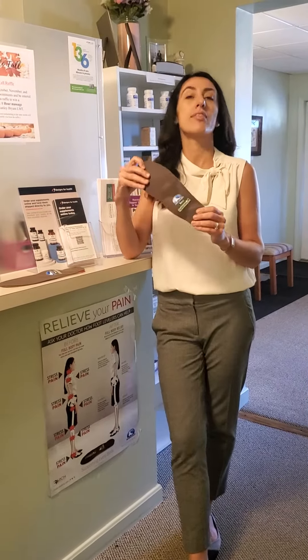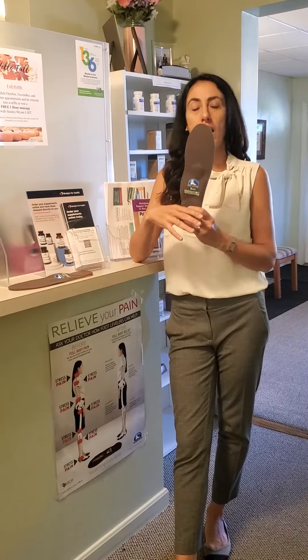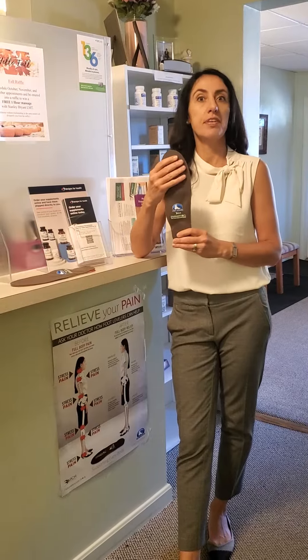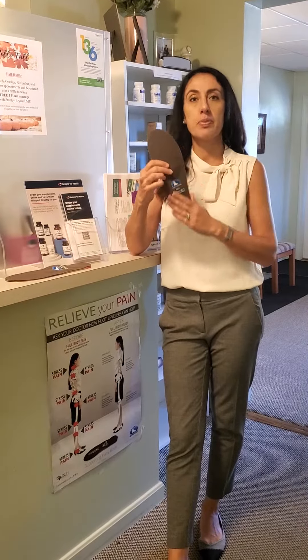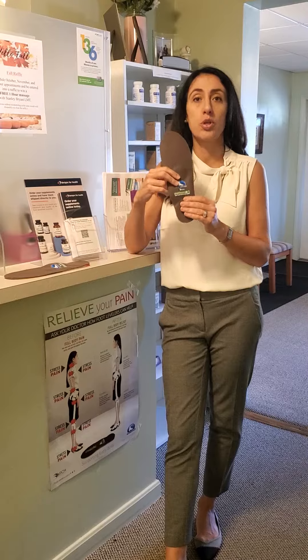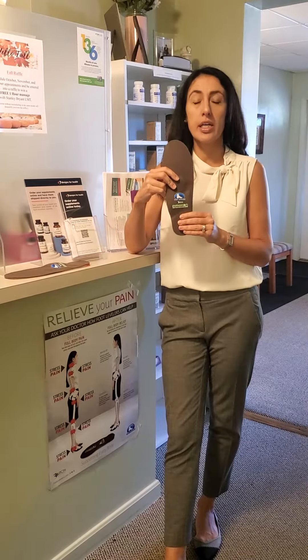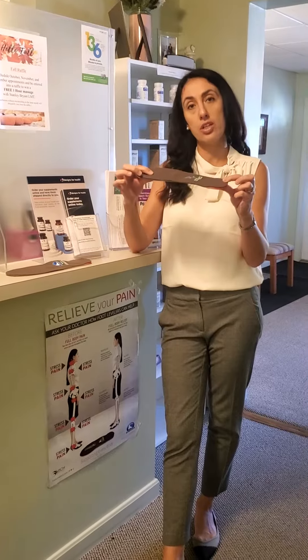Second of all, Foot Levelers makes a variety of orthotics for different needs that we have. For example, in-motion orthotics are designed for someone whose feet may perspire excessively, who might be tough on their shoes. They have a specific moisture-wicking top, and they also have something to control odor and bacteria.